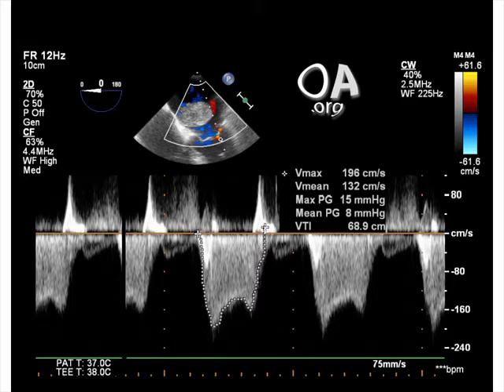Although an in-depth discussion of mitral stenosis and its echocardiographic evaluation is beyond the scope of this Open Anesthesia TEE podcast, briefly, the mean pressure gradient here is 8 millimeters of mercury, which corresponds to moderate mitral stenosis.